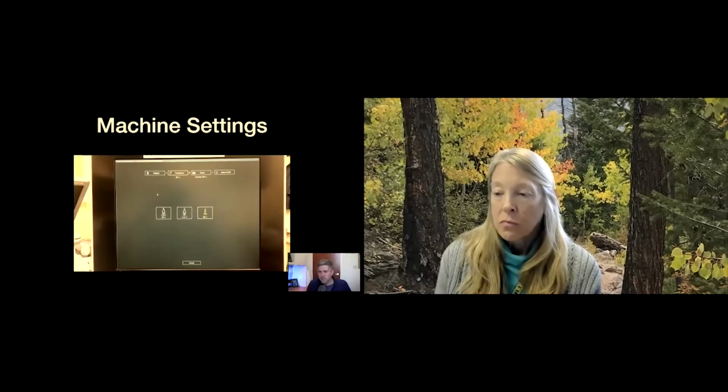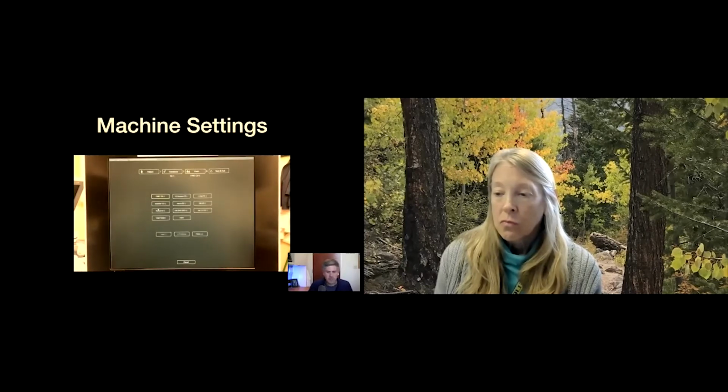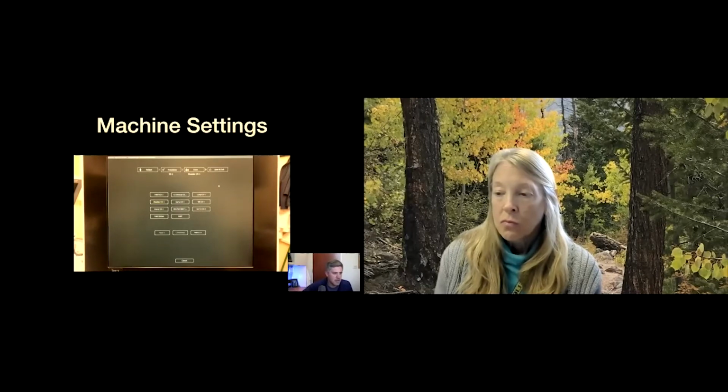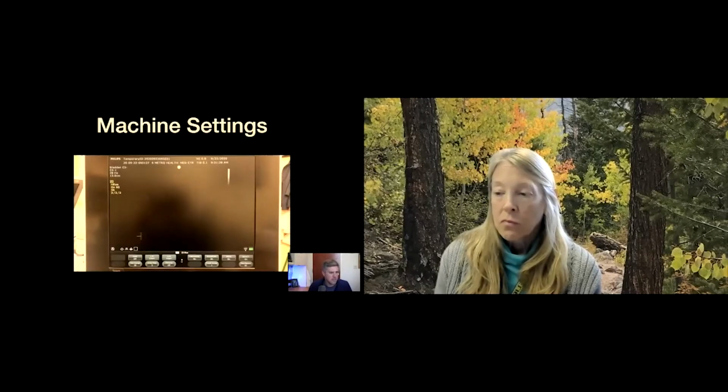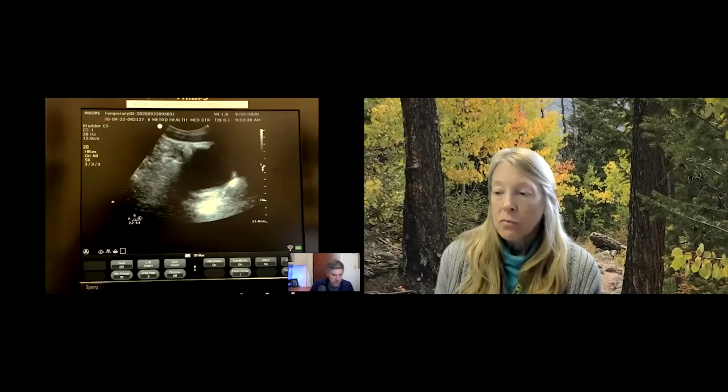Right. So from a machine standpoint, this is an example with one of our machines. We just basically go down that list. We select the transducer, we select the exam preset, and then we go to scanning. So there we select the transducer, we select the bladder preset, and boom, we're ready to roll with that imaging study, right? And then it's time to basically scan the bladder.